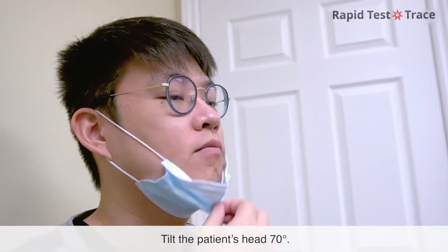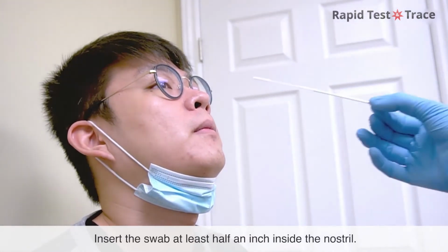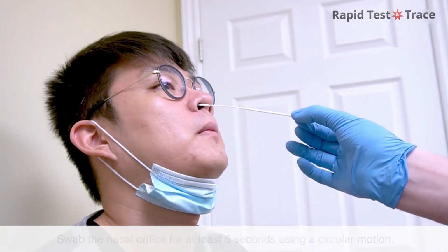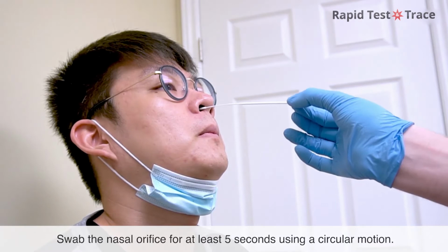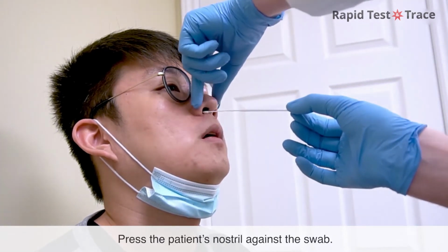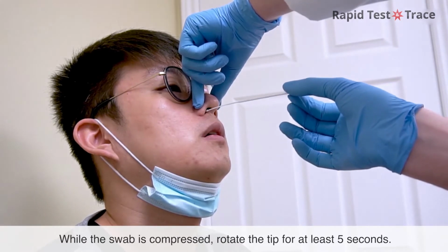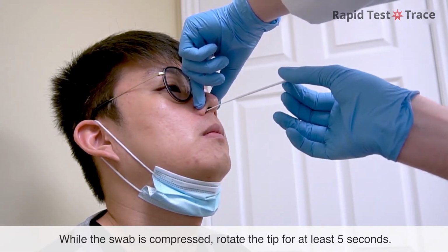Tilt the patient's head 70 degrees. Insert the swab at least half an inch inside the nostril. Swab the nasal orifice for at least 5 seconds using a circular motion. Press the patient's nostril against the swab. While the swab is compressed, rotate the tip for at least 5 seconds.